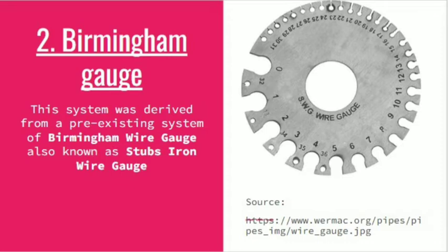And the more the values are increasing, the size of the hole is decreasing. The smaller the size, the greater force was required to pull that hot iron through that hole to make a smaller diameter wire.